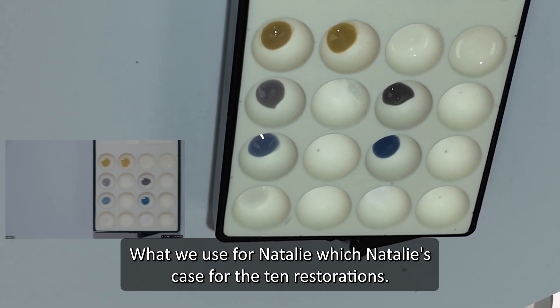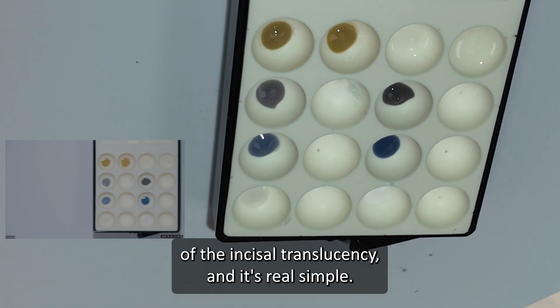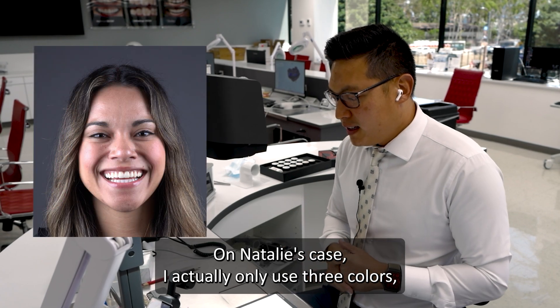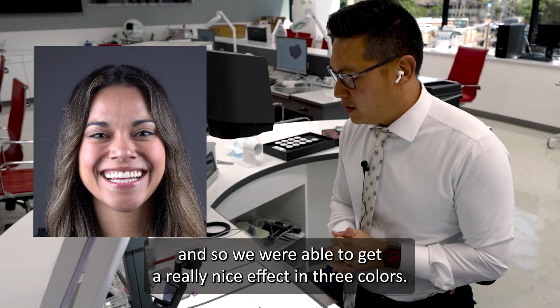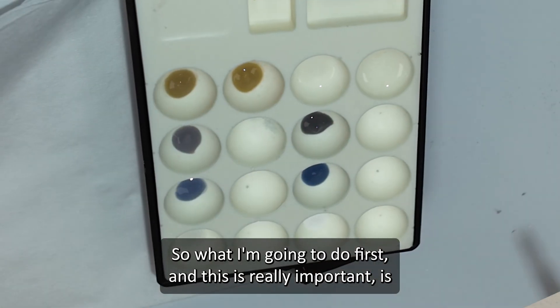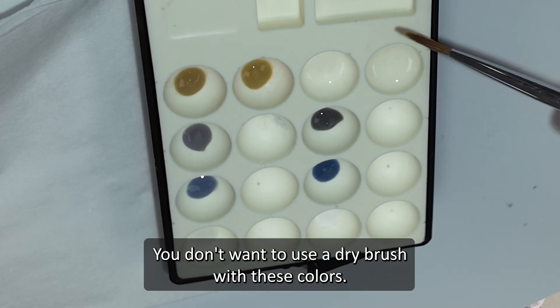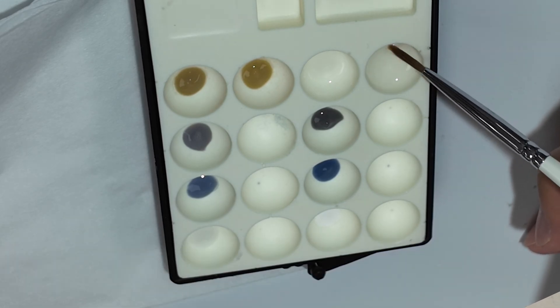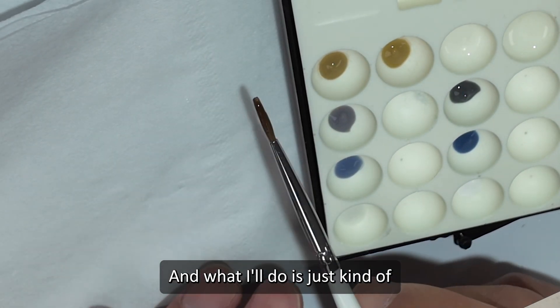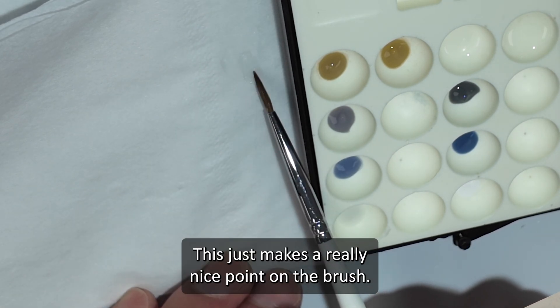I'll first take you through a real simple application — what we use for Natalie. For her 10 restorations, I'm putting a little bit of body shade and a little bit of incisal translucency. On Natalie's case, I actually only used three colors to get a really nice effect. What I'm going to do first — and this is really important — is moisten the brush. You don't want to use a dry brush with these colors. I'm dipping the brush in the liquid, hydrating it, and spinning it on tissue paper to make a really nice point on the brush.